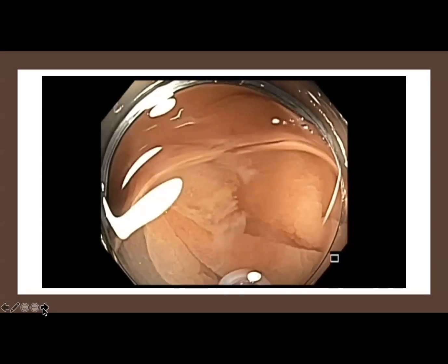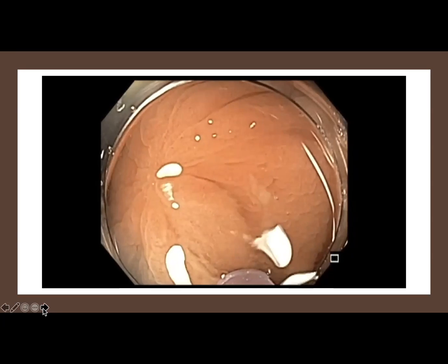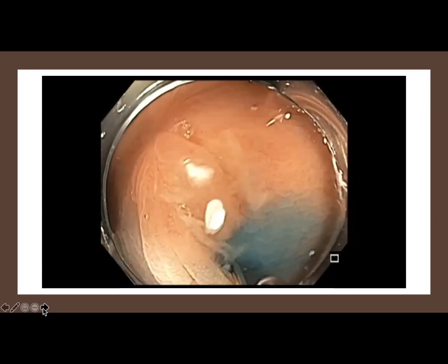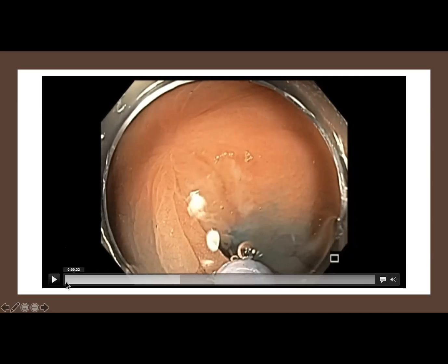So what I decided was, I thought there was a residual polyp, and that maybe I should inject and remove. What would you guys do when you see a residual polyp like that? Would you do just a hot snare straight, or would you try to inject and cut it? And how do you deal with that? It's in the cecum, so it's best to inject and then use a small snare to cut it hot.